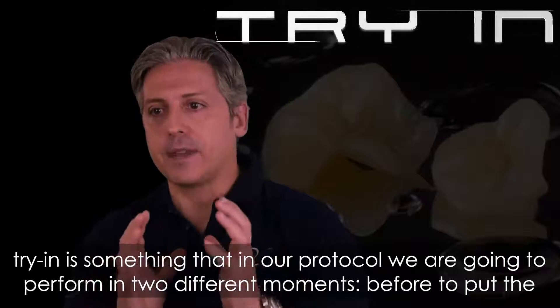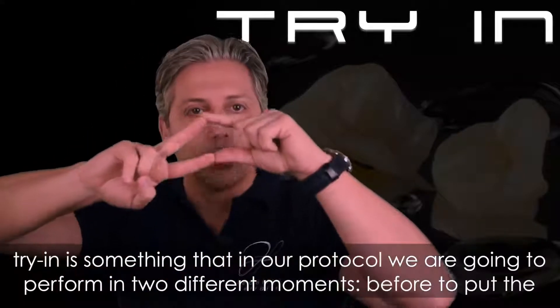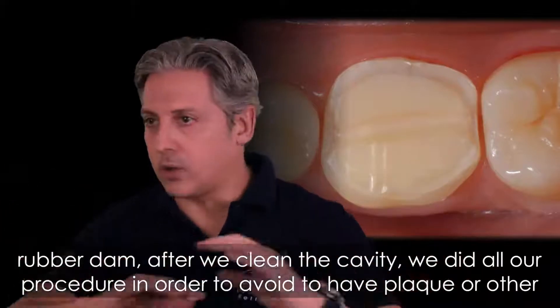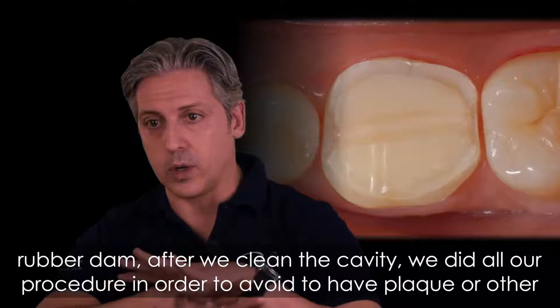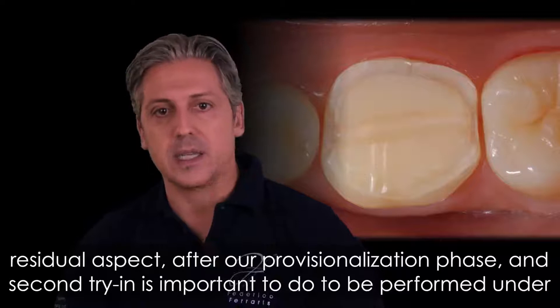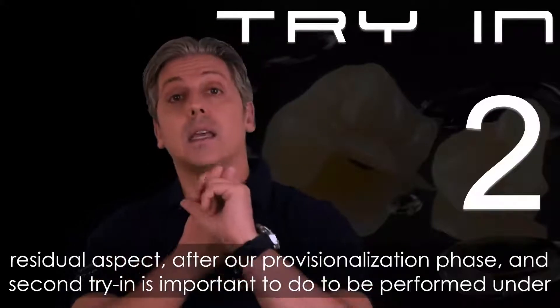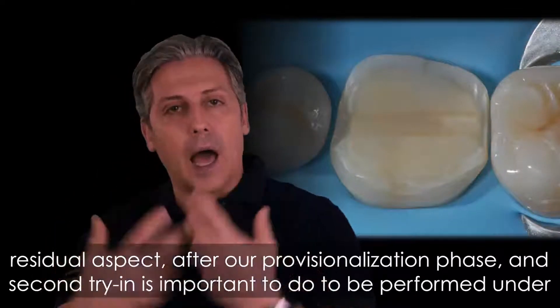The try-in is something that in our protocol we are going to perform in two different moments. The first is before placing the rubber dam, after we cleaned the cavity and completed our procedure to avoid plaque or other residual aspects after the provisionalization phase. The second try-in is important to be performed under rubber dam.